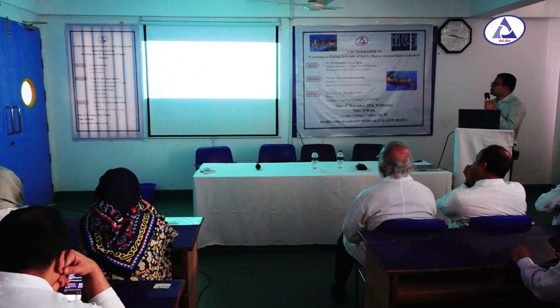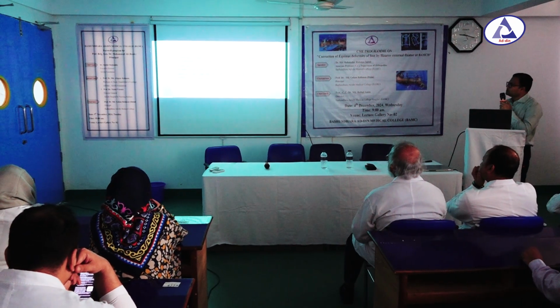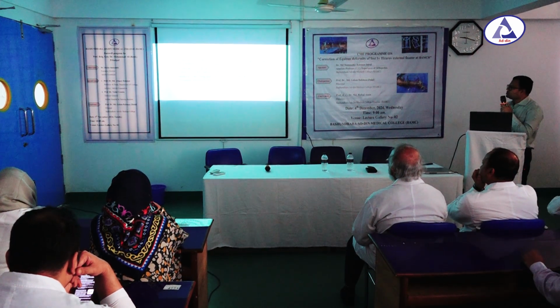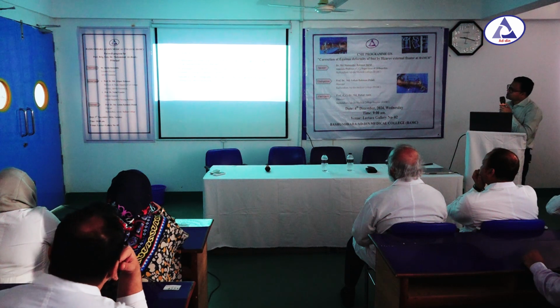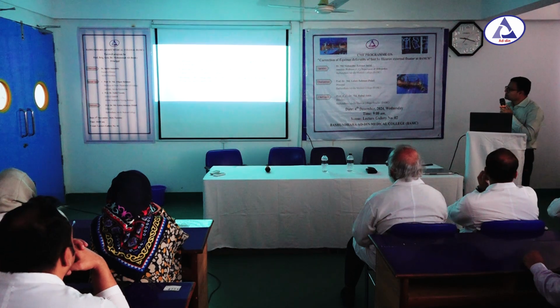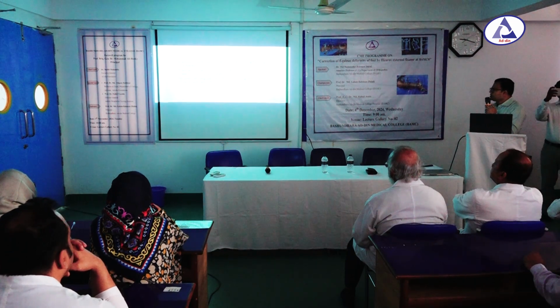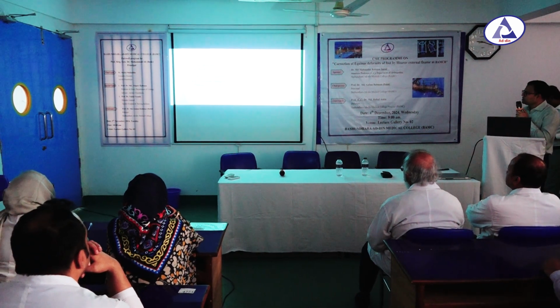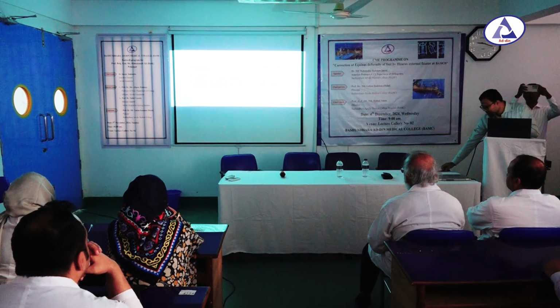It allows preservation of foot size or lengthening of a baseline shortened foot. It allows correction by slow distraction with a lower complication rate. In severe cases where the equinus deformity is more than 40 degrees, gradual correction by this procedure is possible.